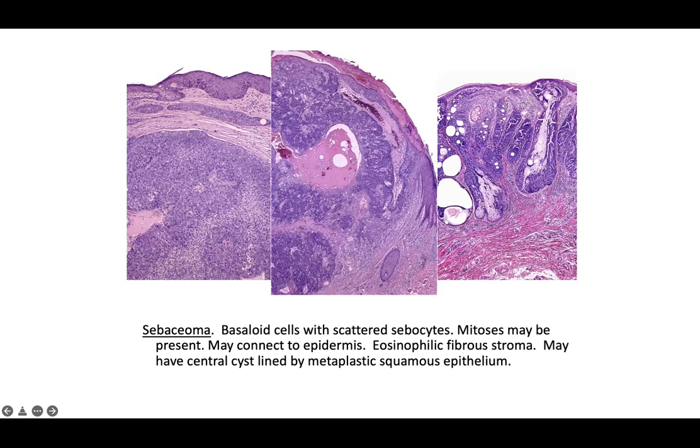For the purposes of an exam, they would probably give you a much more clear-cut example, so that you don't have to debate sebaceoma versus sebaceous carcinoma. In fact, for your dermatology boards, you're probably just going to want to be able to recognize sebaceous adenoma versus sebaceous carcinoma. A sebaceoma is more difficult, but you should be able to diagnose it if it's really well circumscribed and lacks significant invasive architecture, significant cellular pleomorphism, and significant necrosis.